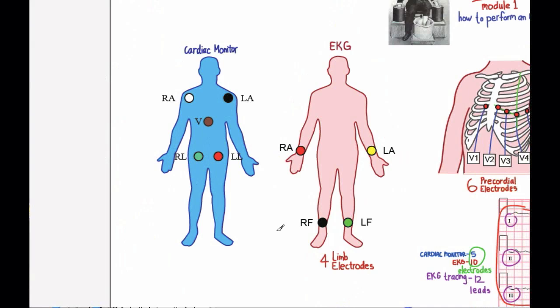There are four limb electrodes. There's the right arm and the left arm, right leg and left leg. The right arm electrode goes on the right arm, avoiding any thick muscle. The left arm one goes in about the same position except on the left arm. The left leg goes just lateral to the calf muscle. And the right leg goes lateral to the calf muscle on the right leg. These are the four limb electrodes.